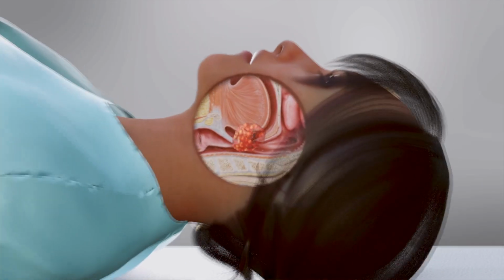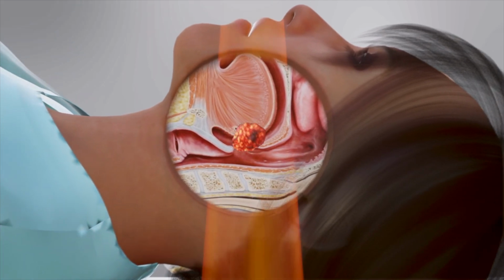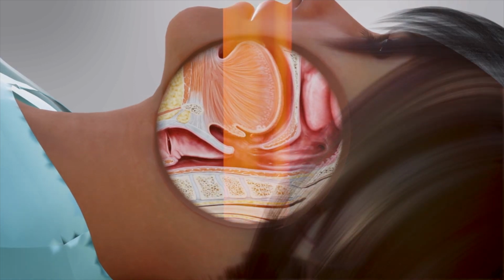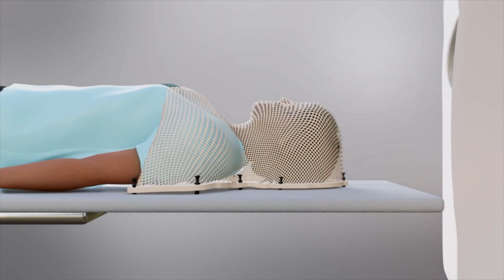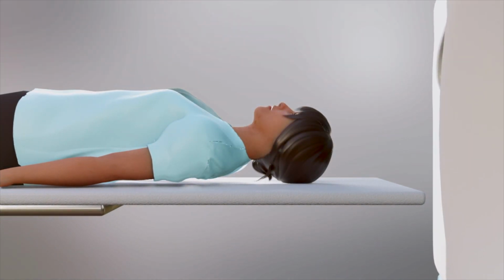The gantry of the radiation machine rotates around the patient slowly. After check-in and positioning, a single treatment takes only a few minutes. Treatment usually takes about 6 to 7 weeks. If chemotherapy or immunotherapy is given, it is typically administered once every 7 to 21 days for a total of 3 to 7 doses and increases the beneficial effect of radiation on eliminating the cancer.